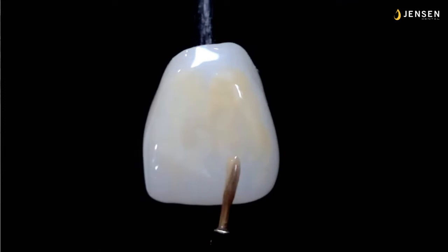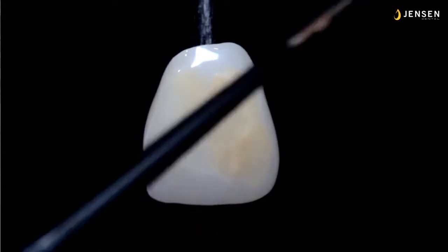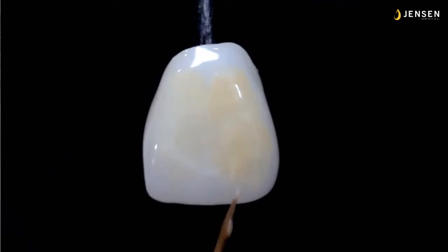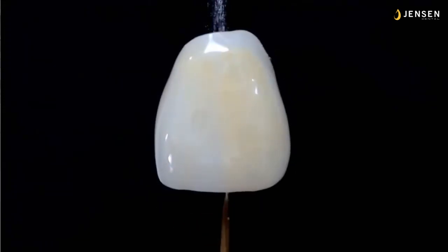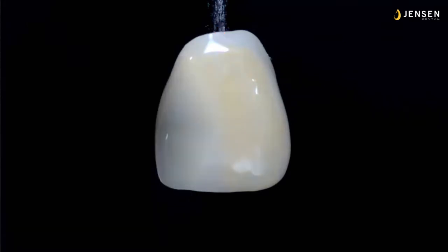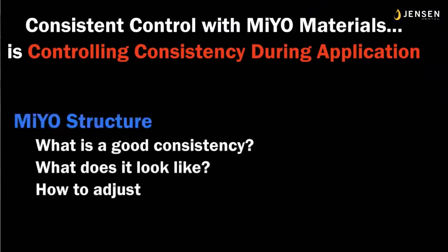All right, so I use a little one MiYO brush, which is the same size as a 5-0 brush. That's a 0-0-0-0-0. And I've noticed that if I just lightly touch, I don't want to push through that paste glaze, but I can kind of jiggle it and get the color to move in a very, very smooth fashion once I get some on the tooth to begin with. So you can see in the distal half of the tooth, I have the dab and drag technique for more chroma intensity. It has less dilution, more chroma, and it's more diluted on the mesial, which gives you less chroma. But regardless, the MiYO paste glaze or the Insync paste glaze will hold it in place.